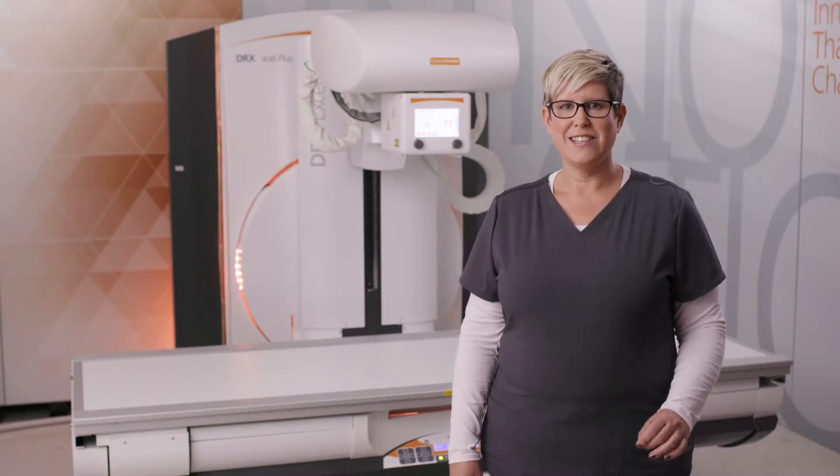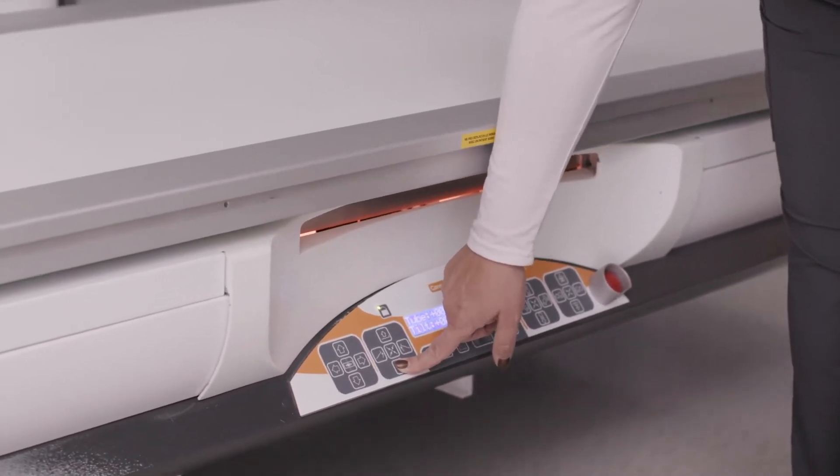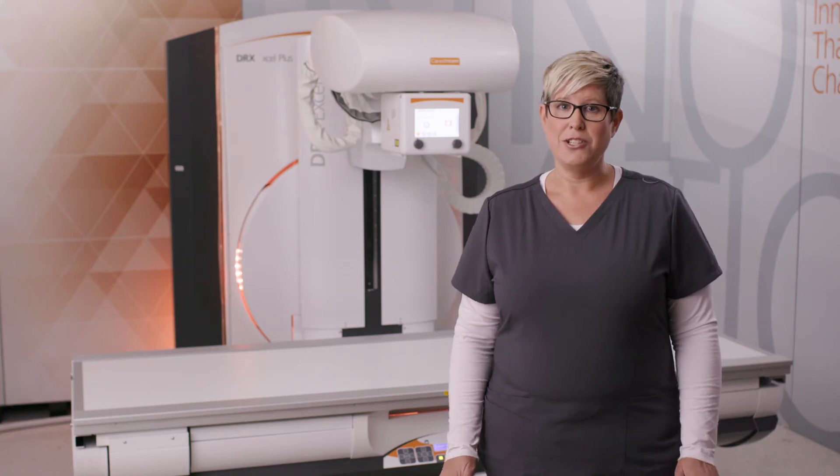The DRX Excel Plus table has a very low profile, lowering to just 48 centimeters from the ground. It is the lowest in the industry, making it easily accessible for pediatric and wheelchair patients.